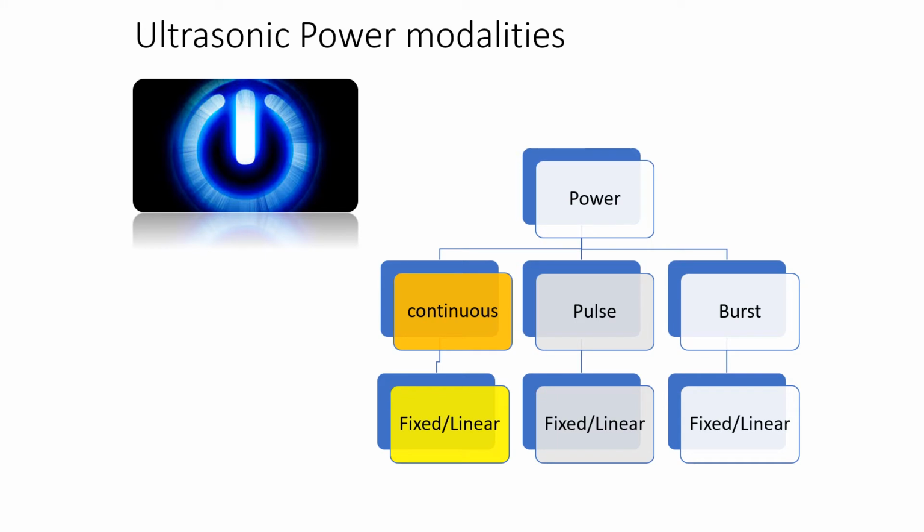So in part 2 of the Basics of Phaco series, we talked about how ultrasound energy delivery is largely a function of two things: the frequency of the phaco handpiece and the stroke length of the phaco tip. We also learned that the frequency of the handpiece is fixed. When you increase the percentage of power delivered inside the eye, you are increasing the stroke length that the tip travels inside the eye. If you decrease the power, you are decreasing the stroke length that the phaco tip travels inside the eye.